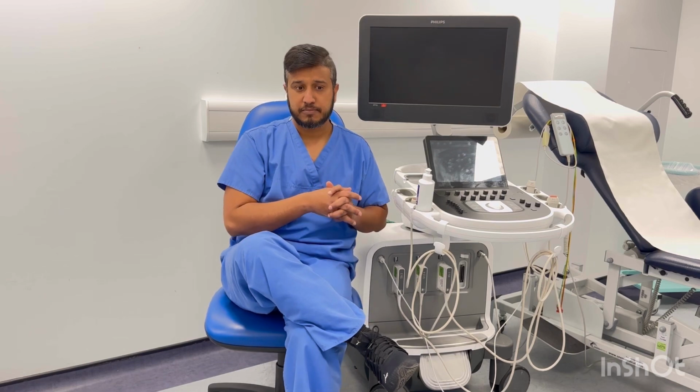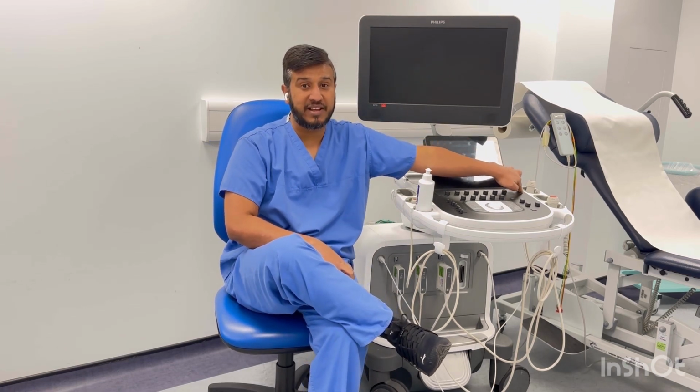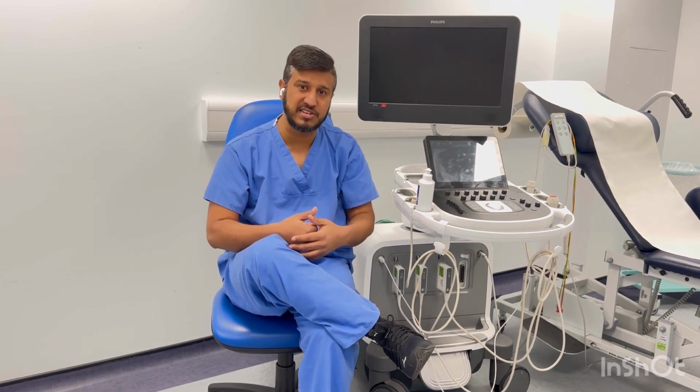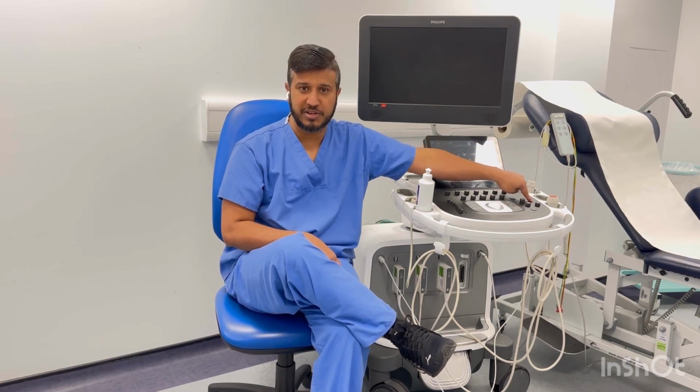Now the next thing is a technical one. Sometimes you may be doing a pediatric patient, or an adult congenital patient, and your patient is a pediatric patient of maybe 12, 13 or 14 years, but he is quite a healthy guy, an obese patient. If you are trying to get the images with S9, you might not get the best images. For that patient, you might need to go to your adult probe to get better images, because your penetration requirement has increased. To increase penetration, you will use a lower frequency probe.